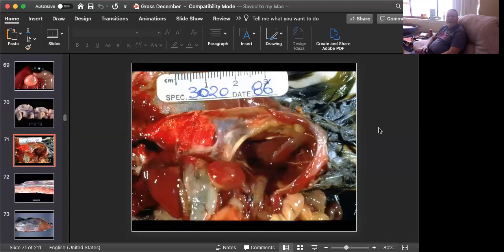Slide number 8 is tissue from a military macaw. These are these really sort of pretty olive drab colored birds. There's a little bit of red on them. They're military macaws. And I need from you 2 morphologic diagnoses and a cause. Okay, time's up on this one.